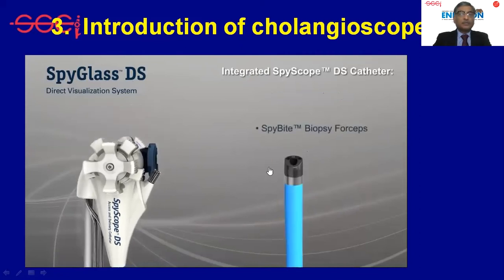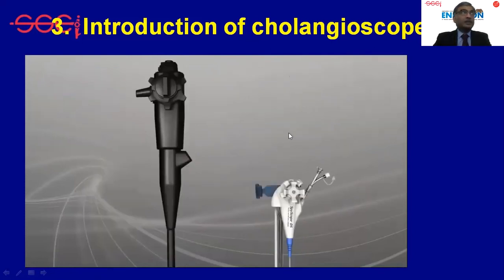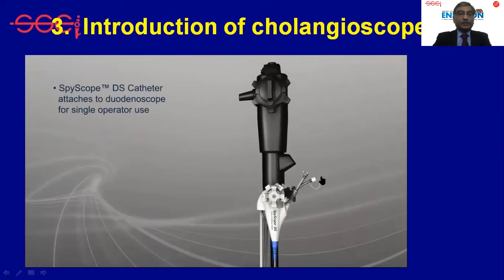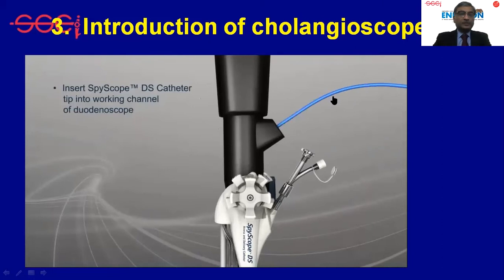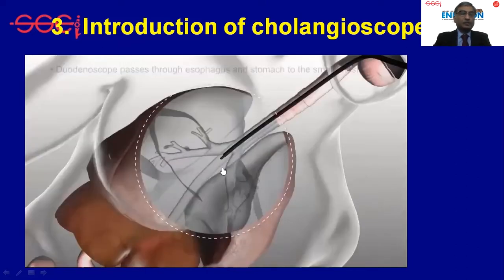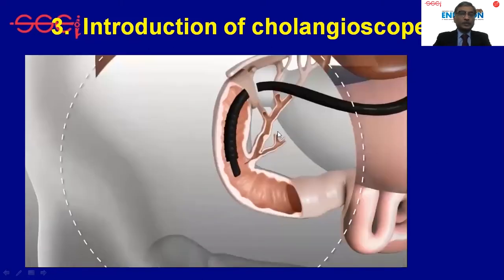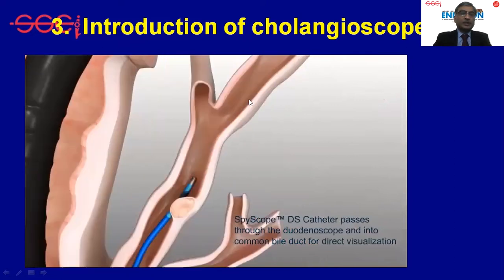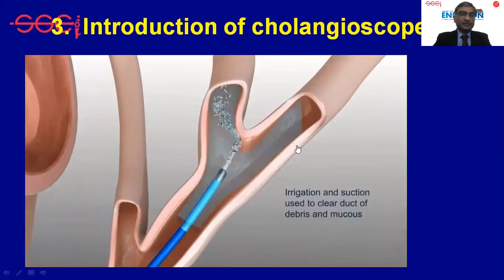The scope can be passed into the bile duct either over a guidewire or directly, allowing strictures to be examined under direct vision. Here the SpyScope is being passed directly, but most of the time we prefer to pass it over a guidewire, which is more convenient for reaching the target site. At the target site, lithotripsy or biopsy procedures can be performed, and irrigation improves visualization and clears the system.